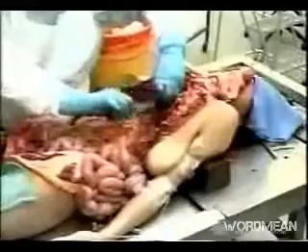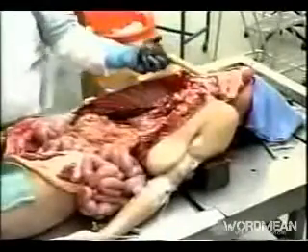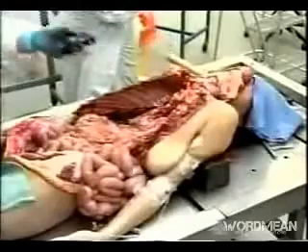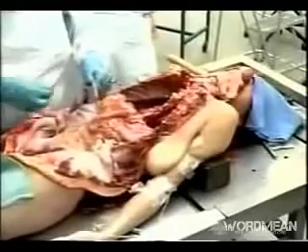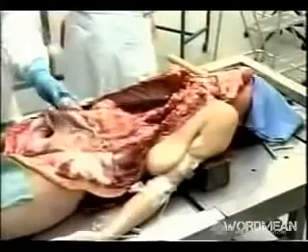Pardon me, the spleen is coming out now. That sits in the left upper quadrant of the abdomen. That's about a normal shape and size. What he's doing now is putting a clamp on the proximal end of the small intestine, the duodenum, and then he'll free up all of the intestine so that it can be removed in a block.